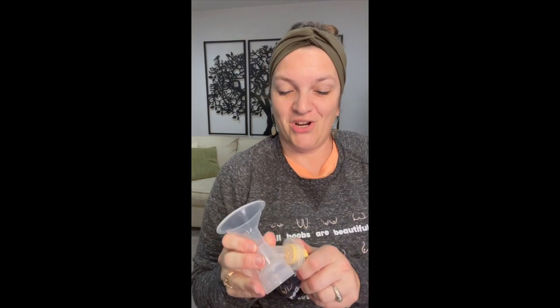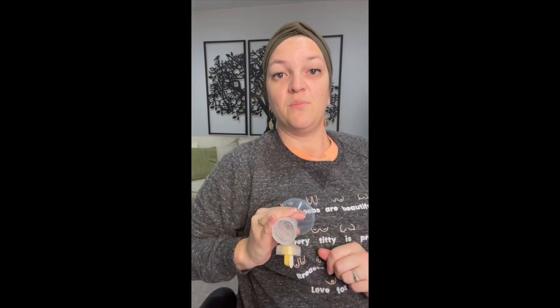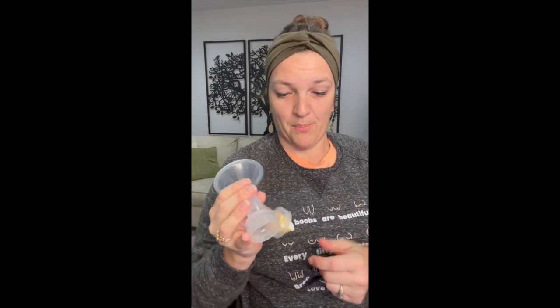Or if you're leaning too far forward, gravity may pull that membrane down and not create enough suction in that tunnel to be able to efficiently empty you. So you want to make sure that you have that valve facing in, because then regardless of whichever direction you are, forward or back, you're still going to generate the appropriate amount of suction to be able to move your milk efficiently with this pump.